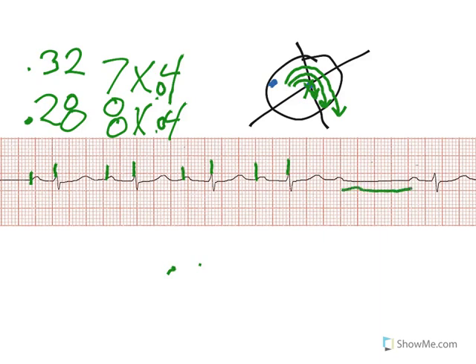And then look at this. The longest drops. Where I would expect to have a QRS complex right there, it's not there. It's missing. What's happened is conduction through the AV node has gotten progressively longer and longer and longer. Then eventually it gets as long as it can get, which means there is no conduction through the AV node. And then the AV node springs right back to that beginning one again, and off we go. The same thing happens over and over and over again.